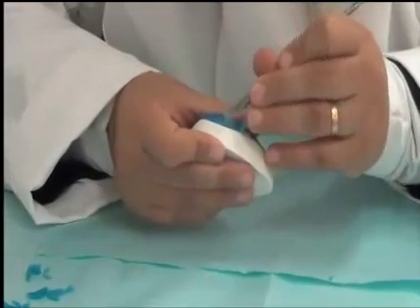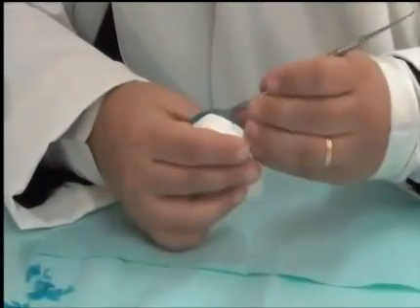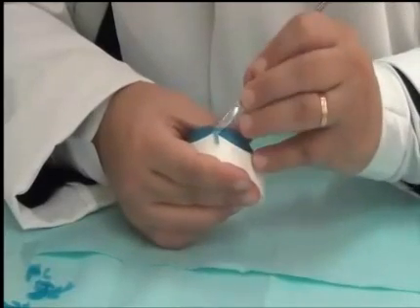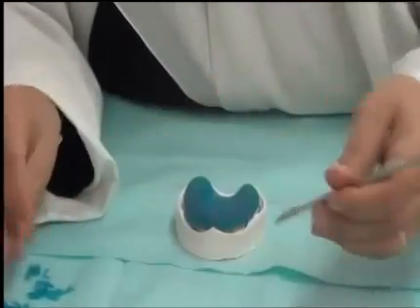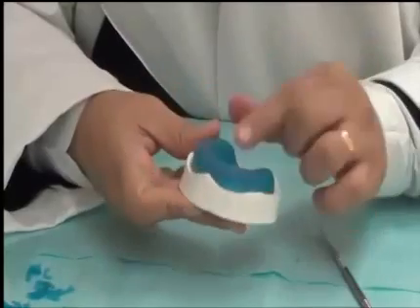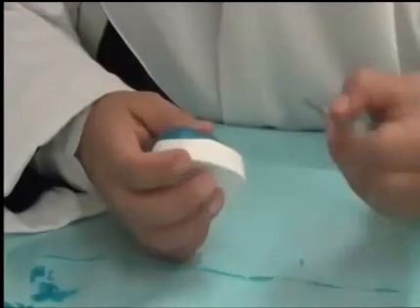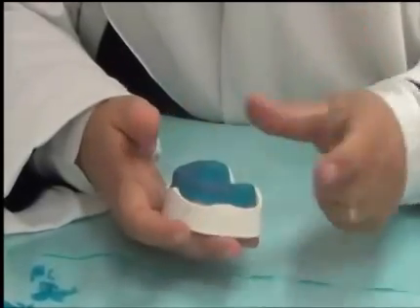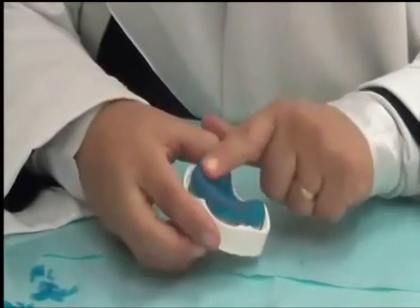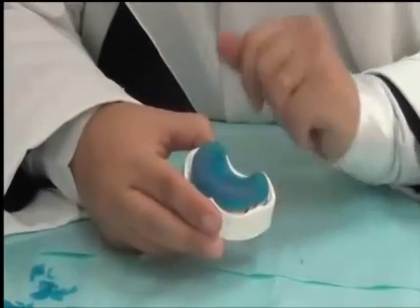So this is our tray material added. Light cured acrylic, once I put it inside the light, will initiate a polymerization reaction, and this polymerization reaction might cause it to shrink a bit. And this shrinkage or polymerization of the material might take the tray away from the tissue. So there are methods where we cure part of the material first, and we light seal this surface, and then cure the surface alone.